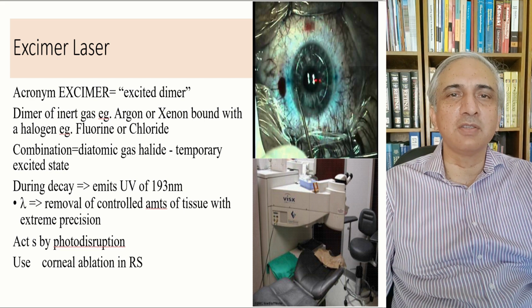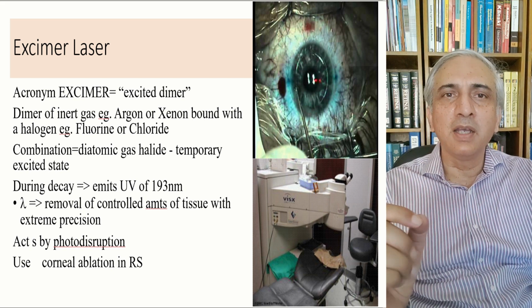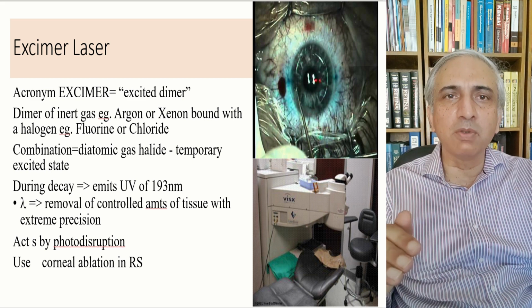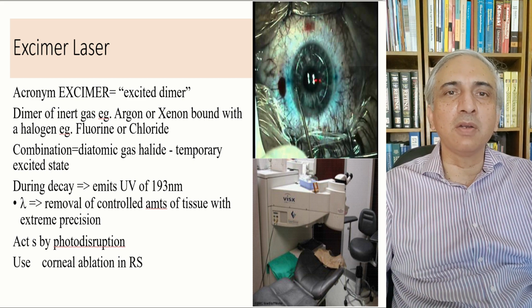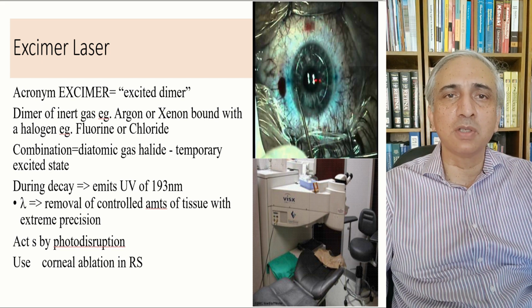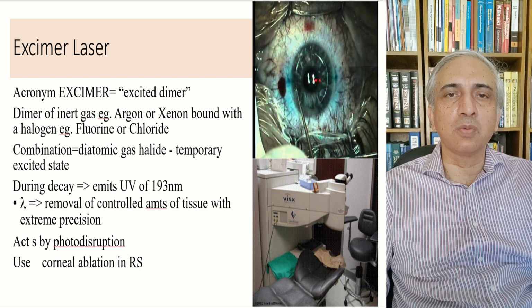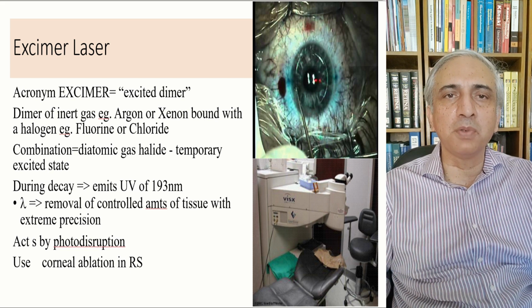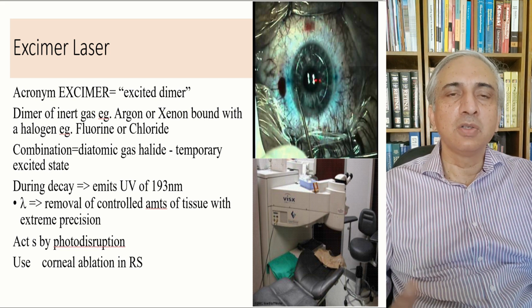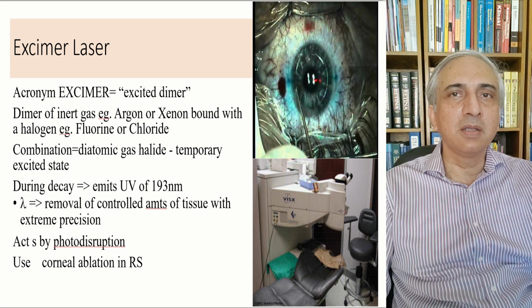But you need to know that the machine which uses the argon fluoride needs to be kept at an optimum temperature, so air conditioning needs to be working in the operating room where the refractive surgery or the excimer is housed, in order to keep it at the working level, otherwise it will not work. So you need to keep the humidity and the temperature control in those environments where the refractive machine is placed. So the air conditioning is working even when there's nobody in the room or when there are no patients in the room.